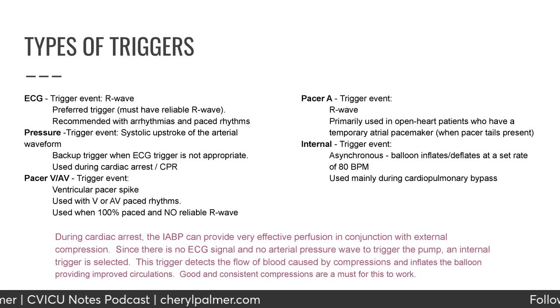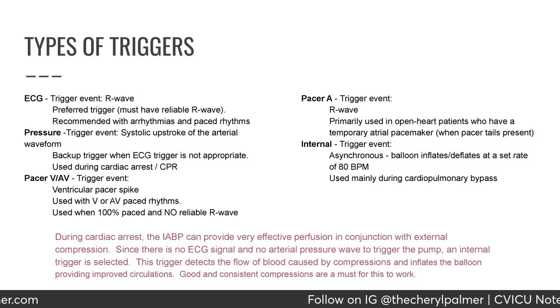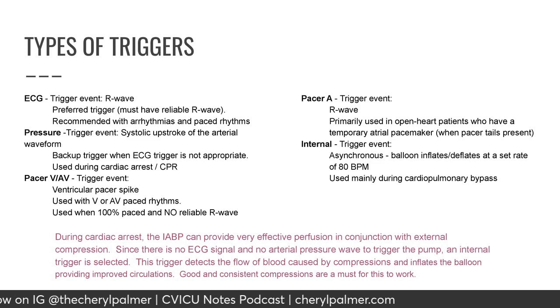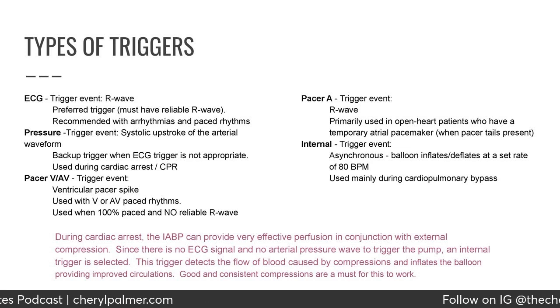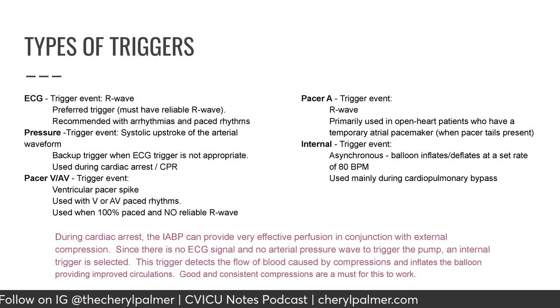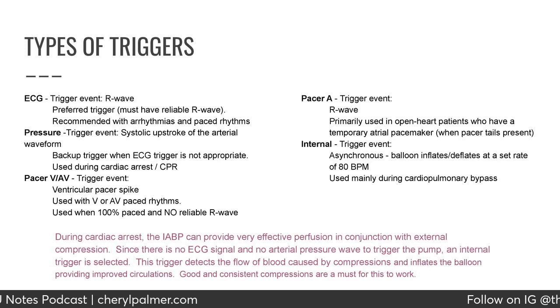Of note, during cardiac arrest, the balloon pump can provide very effective perfusion in conjunction with external compression. Since there is no EKG signal or arterial pressure wave to trigger the pump, an internal trigger is selected. This trigger detects the flow of blood caused by compressions and inflates the balloon, providing improved circulation. Good and consistent compressions are a must for this to work.